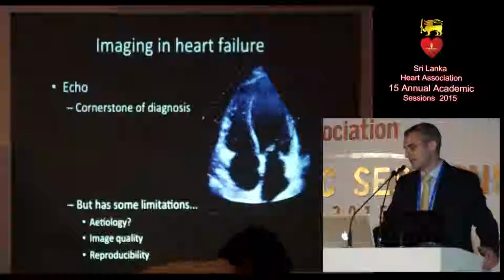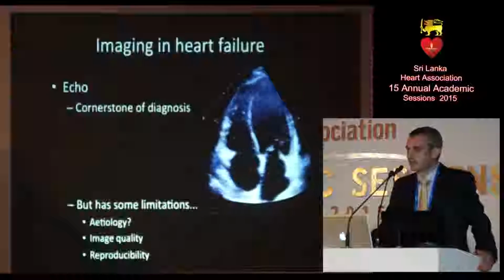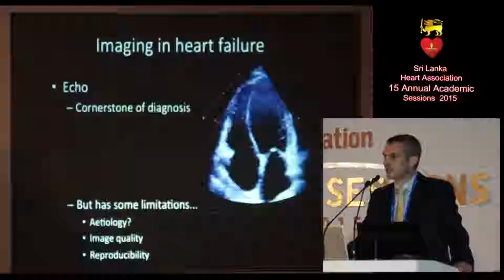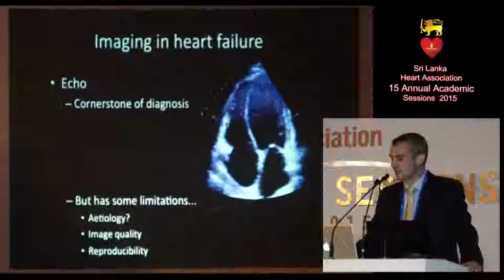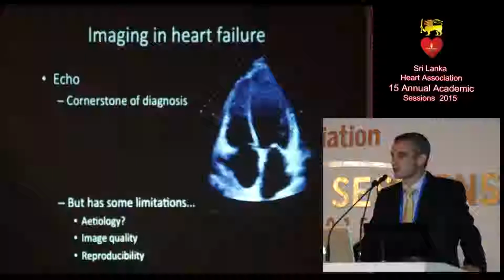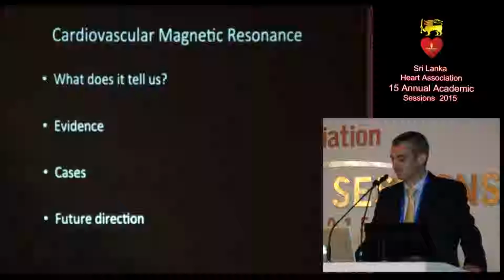And for that reason, over the past few years, a real change that we've seen, particularly in the UK, is a move towards increasing use of cardiac MRI in imaging for heart failure. And that is an early use of MRI scanning, so using it early in the diagnostic pathway, and using it in many patients instead of coronary angiography. So I'm going to explore a bit behind the reasons that we do that, and then show some cases which will hopefully support that approach and provide something to understand that a little bit more.